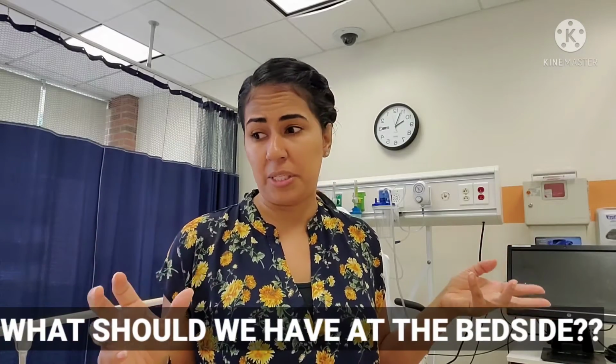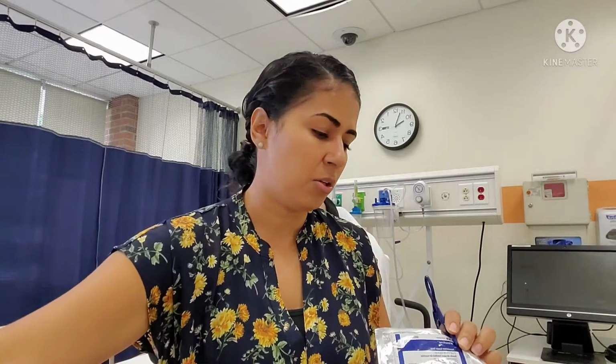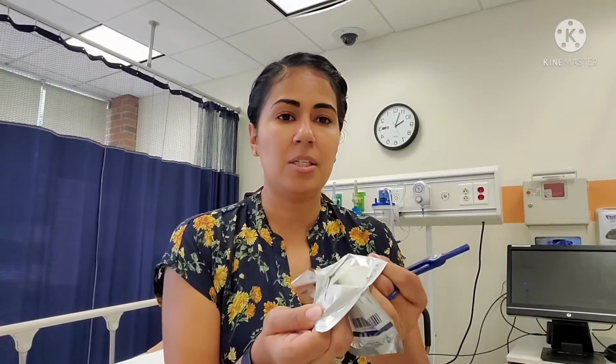Now, sometimes the chest tube comes out without us being ready for it to come out. So it's very important that we have a few things at the bedside, okay? Depending on your hospital facility, you might just need regular 4x4 gauze, or you might need a petroleum dressing, which is just a Vaseline gauze, and I'll show you what that looks like, okay? So it's very important that you know what your hospital policy requires. Your textbook might say the same thing. So for your test purposes, go ahead and look at your textbook and go with what your teacher has taught you.